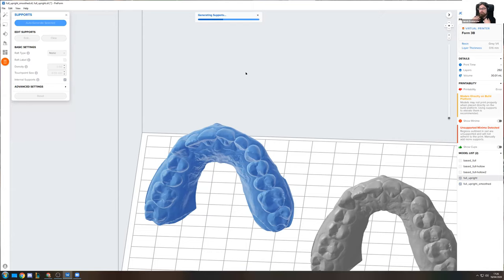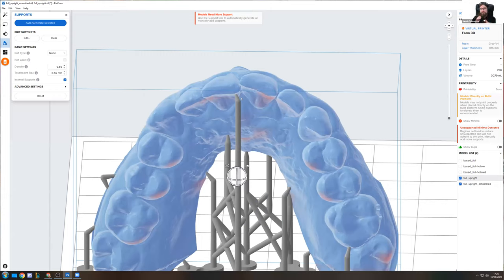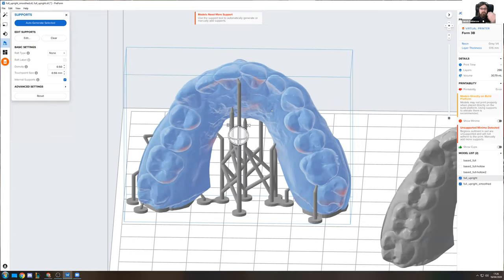One of the things that helps me personally while using the Preform software, I can see that a couple of you have questions and they seem to come from already using the software. We can see that there are some red shaded areas right here that would be taking off the support. One of the things that helped me quite a bit is stopping to think in up or down in terms of Preform, because if you look at it like this, as this is basically upside down, this can get confusing quite fast. So the way I'm thinking about Preform when looking at these models, and that also helps me with these red shaded areas, is not thinking of up or down, but what prints first and what prints last.